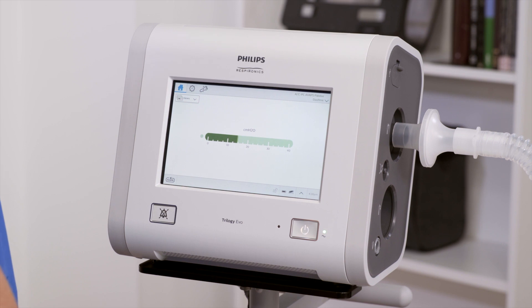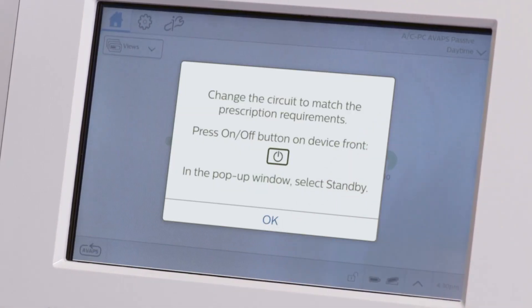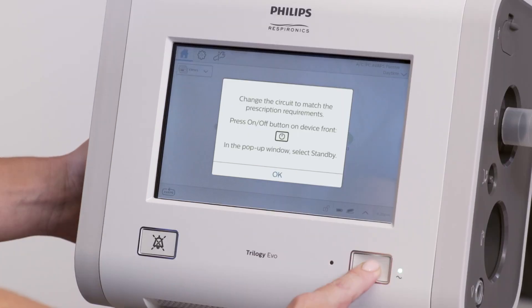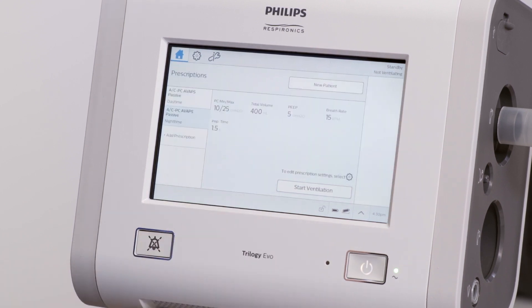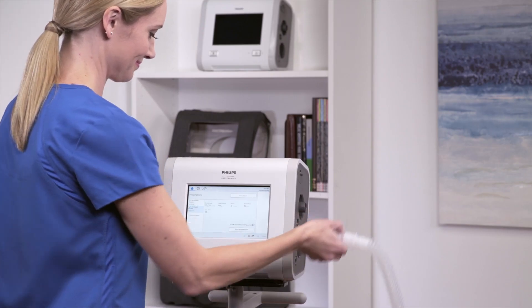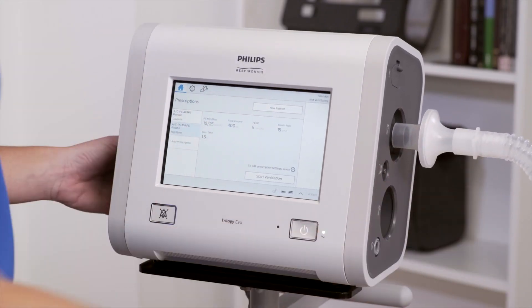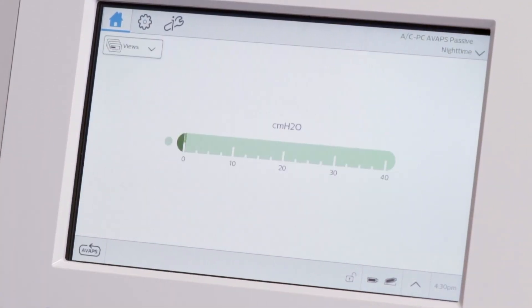To change prescriptions, tap the current prescription in the top right corner and then choose the new one. Read and follow instructions in the dialog box. In this example, the circuits are different — both passive, but one has active humidification and the other does not. Follow the instructions to place ventilation in standby by pressing the on-off button on the front panel. Change the circuit, and select the appropriate prescription from the home window and press Start Ventilation.